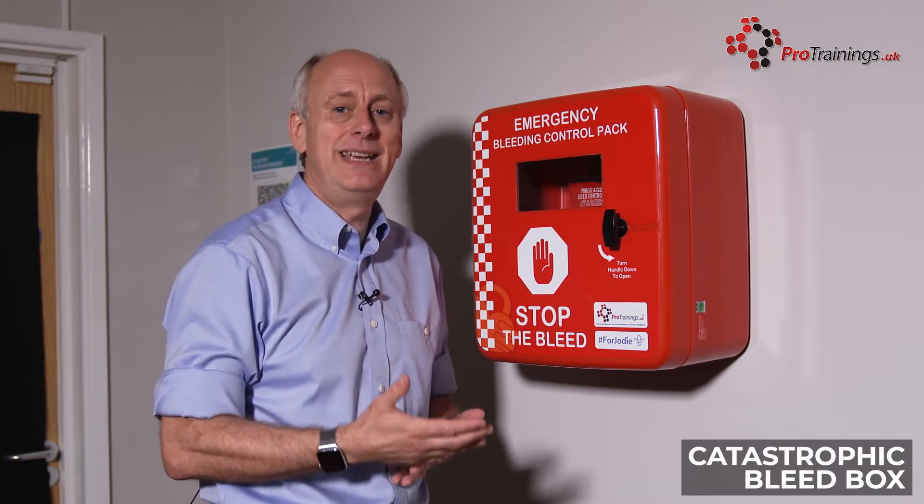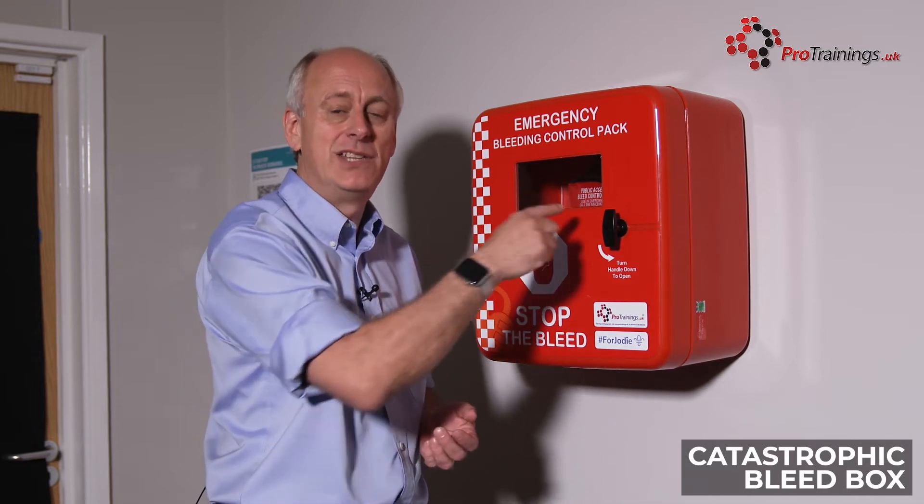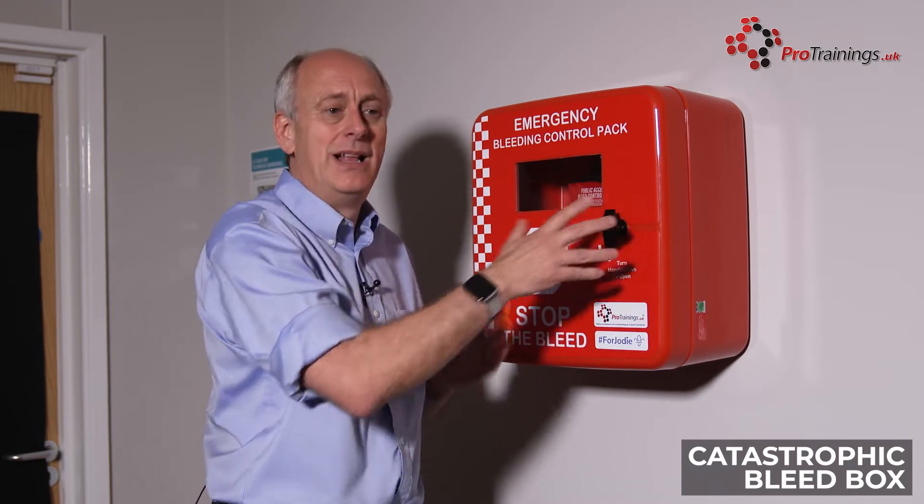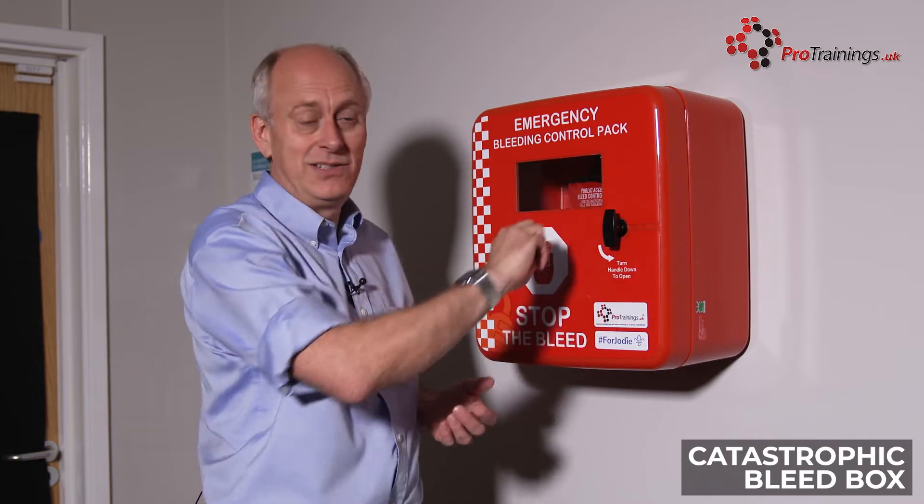So in the event of someone needing a catastrophic bleed kit, they enter in the digit code, hit enter, and they will be able to gain access to it. With the internal ones, you just turn the knob.